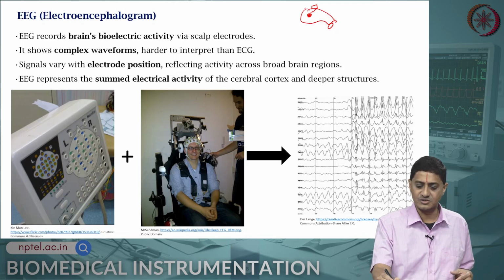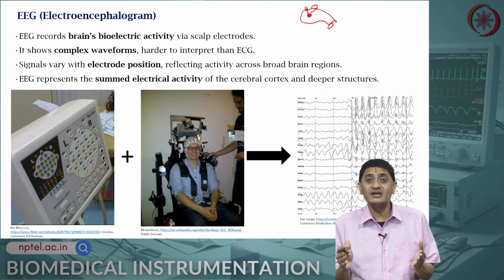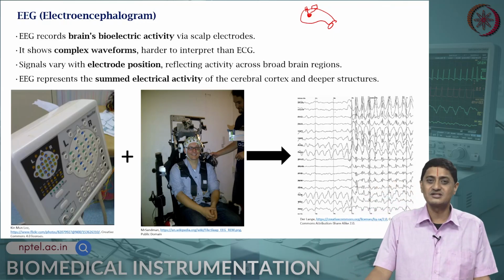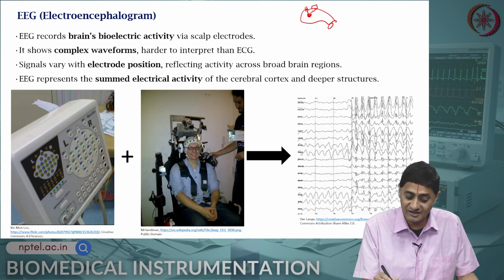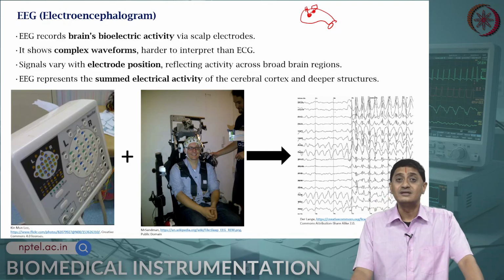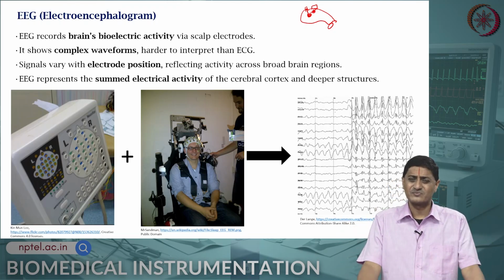By the way, I might also be able to measure something here, because the rest of the tissue in the brain is also conductive tissue. Because of that, due to volume conduction effect, I will be able to measure activity that is happening somewhere deep. By the way, there might be some activity happening here also along the way. So, what you are measuring is essentially a field effect due to multiple neurons.